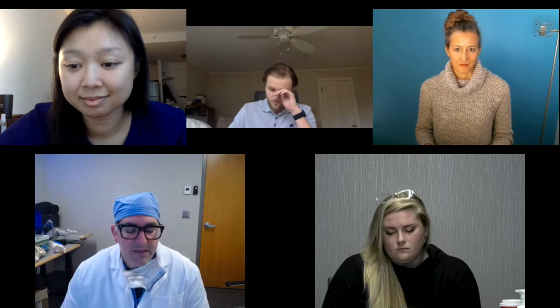Well, I think you have to have a desire to do so, which I think you should, because if you have a medical error based on something that you've created, like a mirror image happens, or you're sending a guide to the OR that doesn't match the patient's anatomy or slides too far up or down the bone, and a surgeon cuts through a tumor, or even does a wrong-sided procedure for wrong-sided anatomy, it's a massive ordeal, and it would potentially harm a patient. So I think you definitely should want to enter into this space.